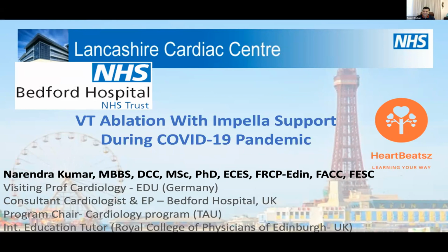Thank you so much for sharing from the great treasure of knowledge, especially about the ventricular arrhythmias. I am aware that nowadays, as you shared in some of the slides, the hybrid approach is getting popular. For example, using dual catheters from different sides to increase the transmurality and the depth of the lesions.